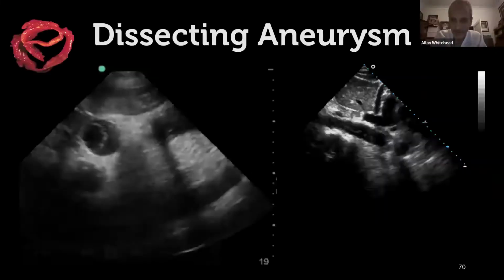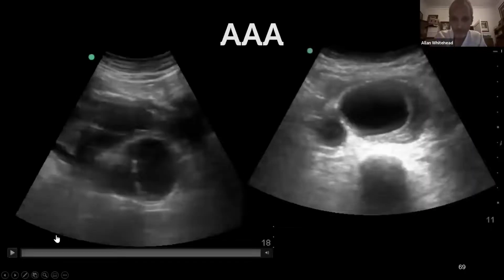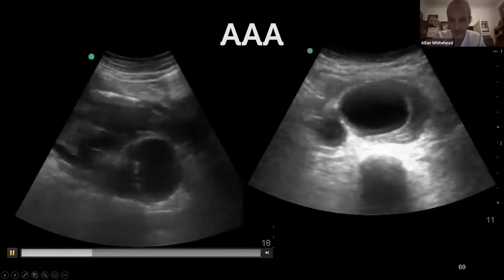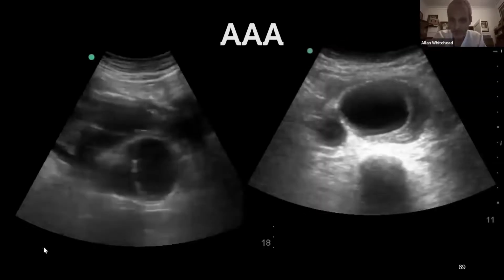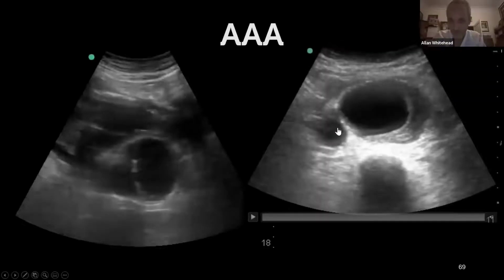On that, now when you have a Sue-Ann, just on that picture, if you just go back to the one that you were just on, the one on the right side of the screen as you look at it, so not my case, but the other case, that fluid to the left, is that outside the wall? I mean, that looks like it's outside the wall. It's not part of a flap, is it?